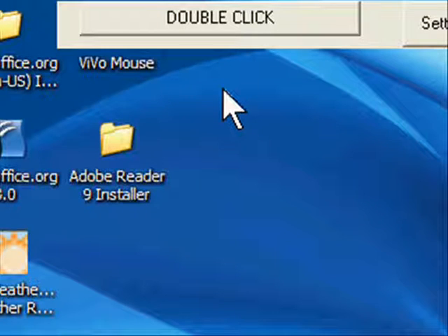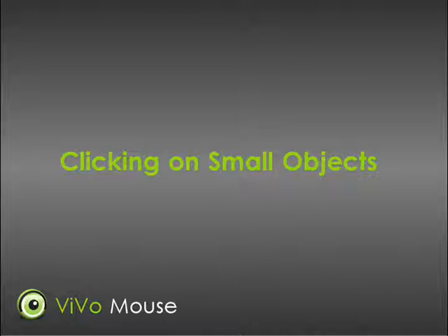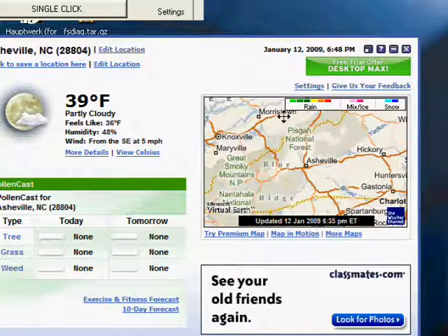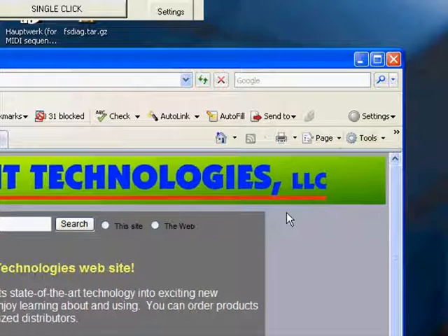If you want to change the type of click, just move the mouse pointer to the VivoMouse control bar and hold it there until it flips to the kind of clicking you want. The VivoMouse also detects when you are zeroing in on a small item to click on it — it automatically slows down so you can be sure to click on exactly the spot you want. After you click, the VivoMouse once again returns to its normal speed.